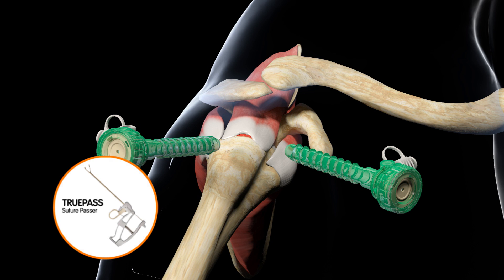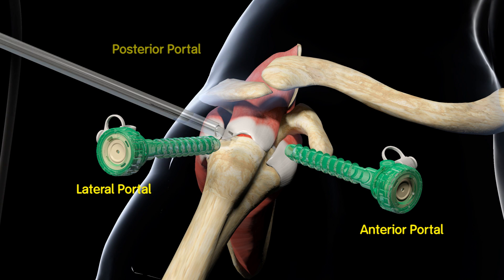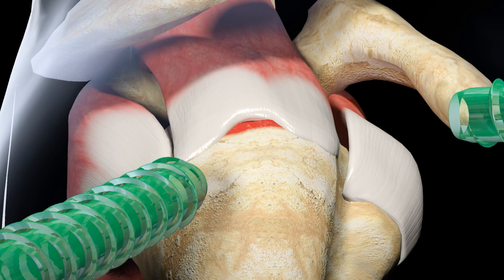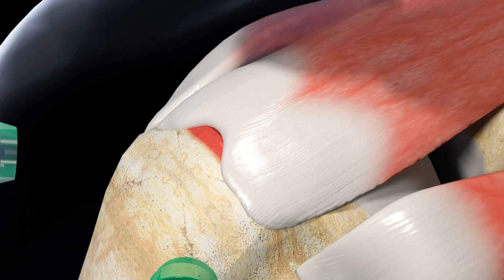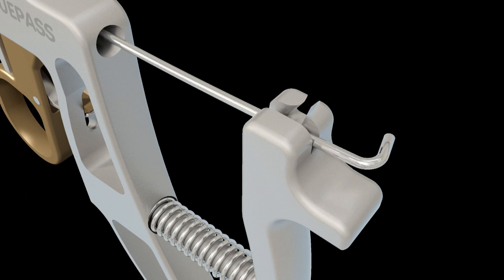This technique is achieved by using an anterior portal, a lateral portal, and a posterior portal. Visualization during the repair steps is accomplished through the posterior viewing portal. In preparation, a bursectomy is performed, assessing the mobility and nature of the tear. The first step is to pass an Ultra Tape Suture through the tendon to create an inverted mattress stitch.